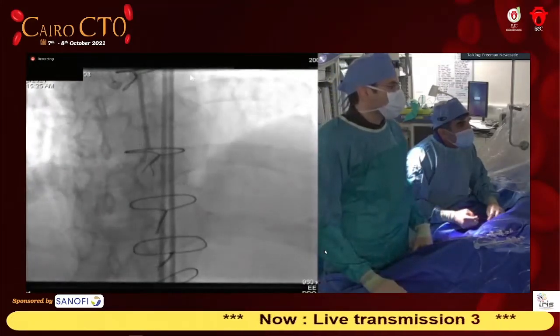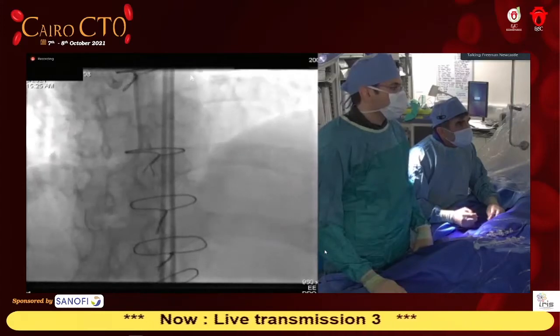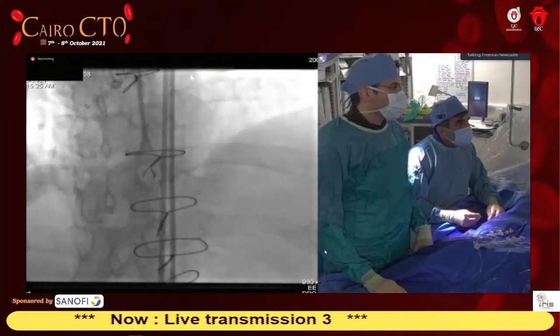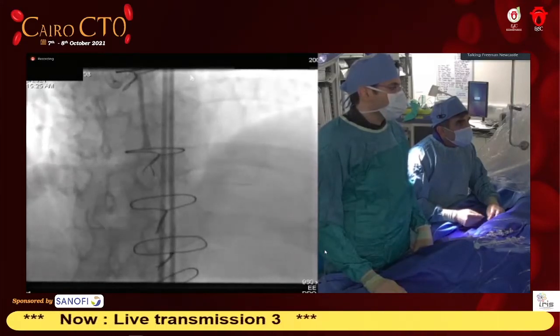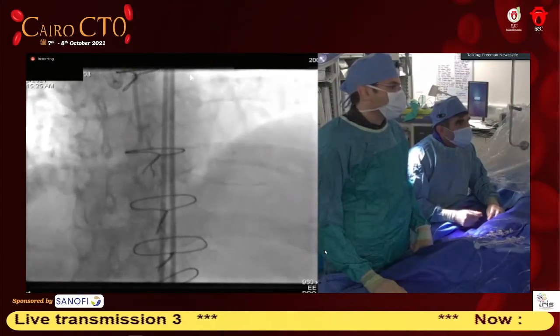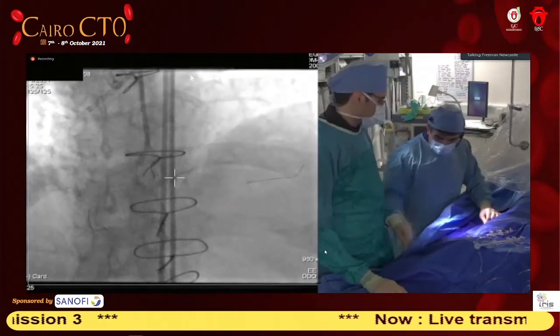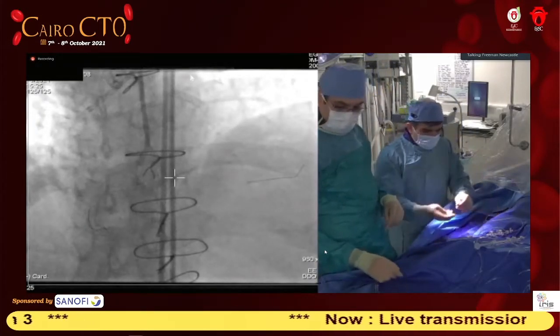Don't forget, this is probably because of surgery. Usually the fibrosis and manipulated artery over there to be able to put the vein graft in, and I think you have a lot of fibrosis. We could take a guideliner, which I think is going to have to be done to get a stent down there. But what we'll do is let's have the fresh 2520 balloon, please.